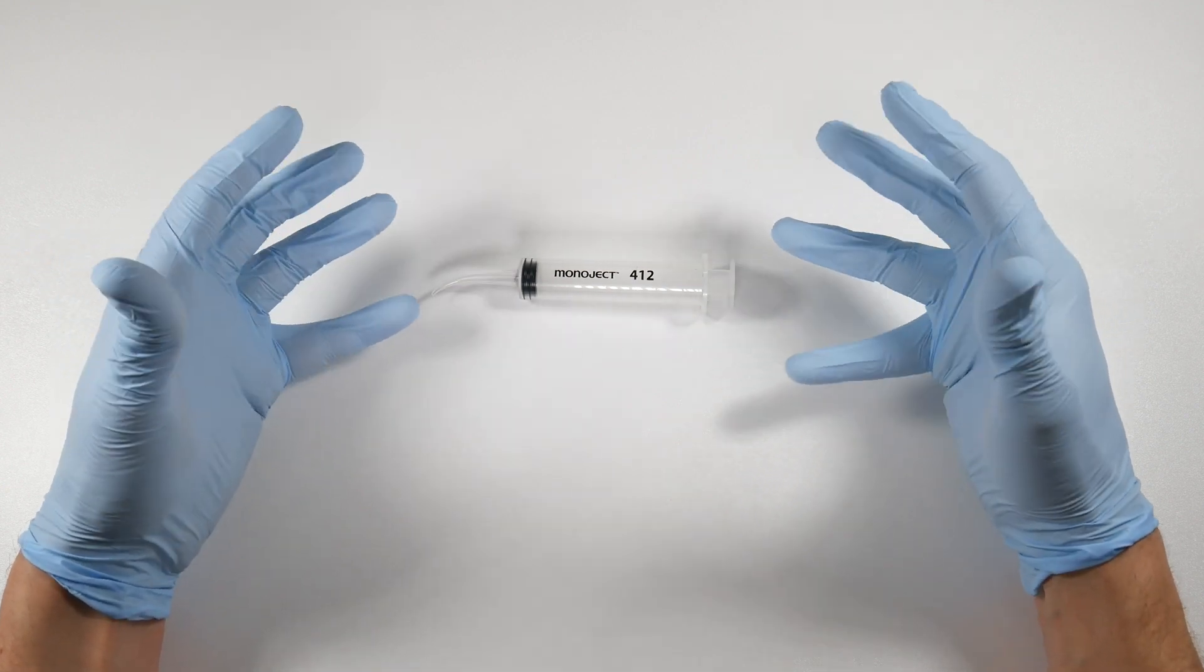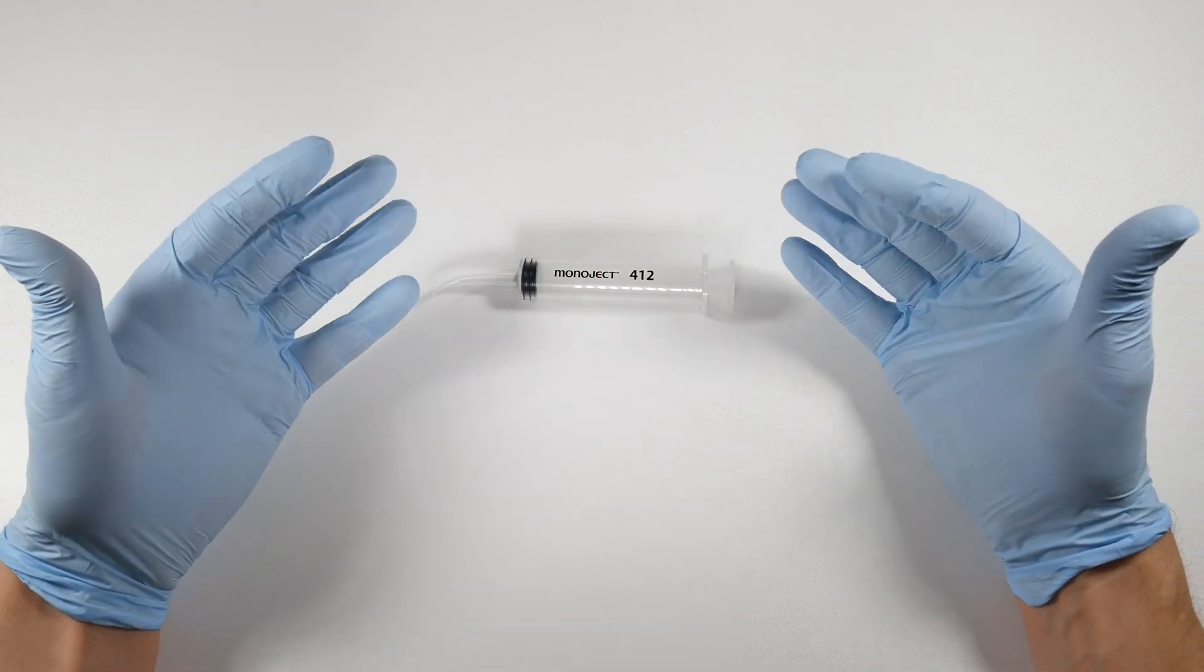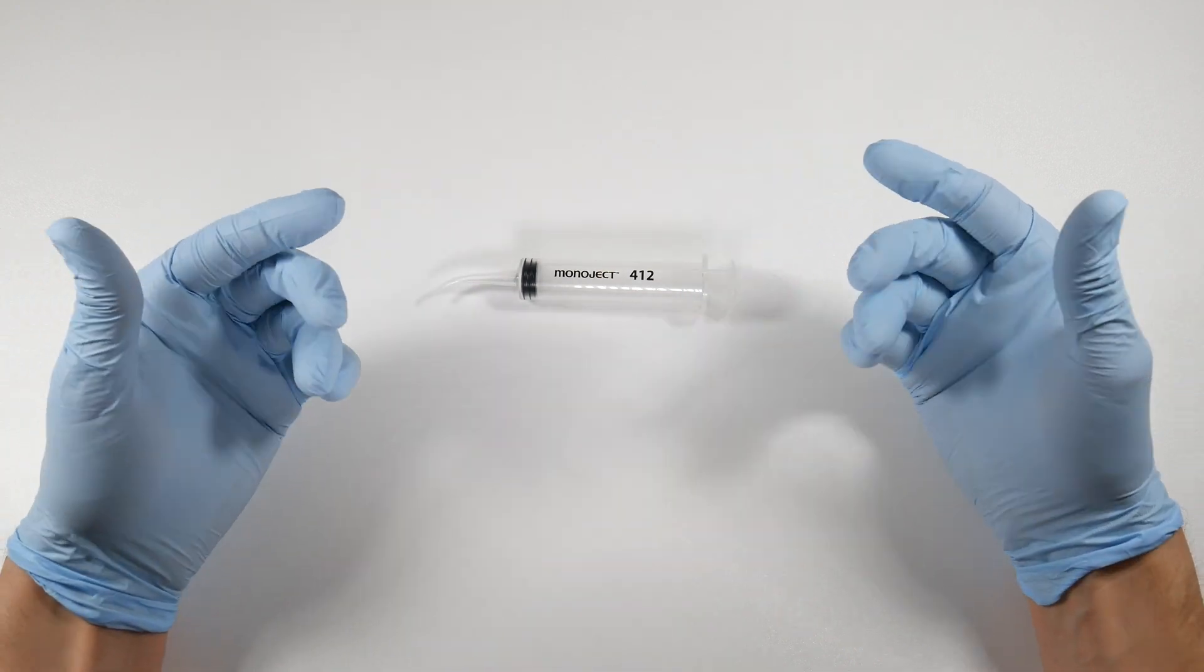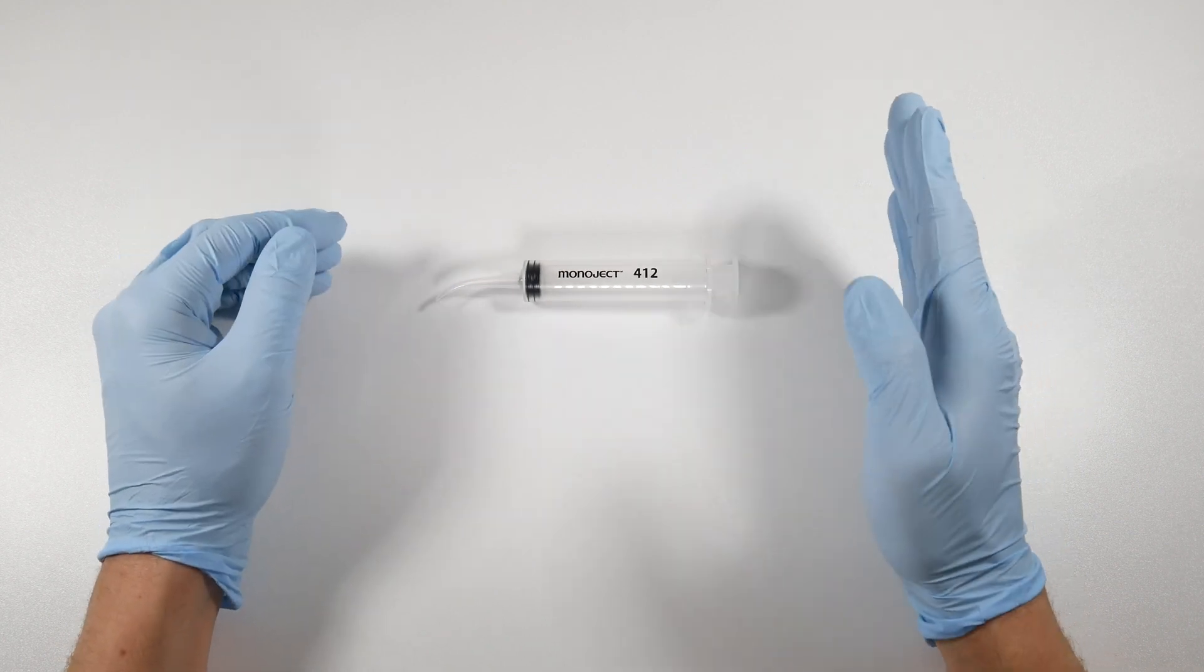I find that the peroxide actually bubbles up nice, which helps to carry some of the debris and food out from the socket and continues even after you've irrigated, which is nice. So I do that and I dilute the peroxide a bit with chlorhexidine.